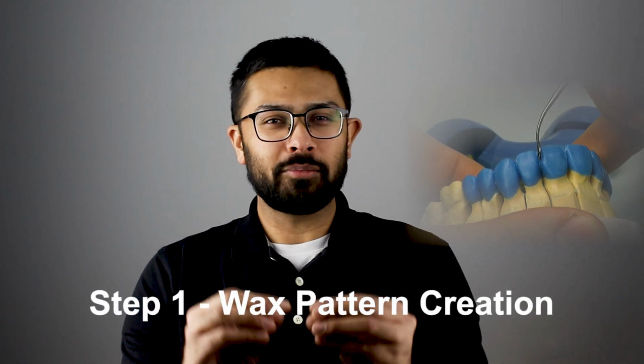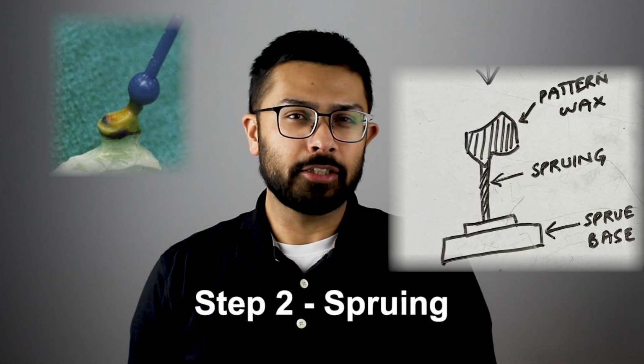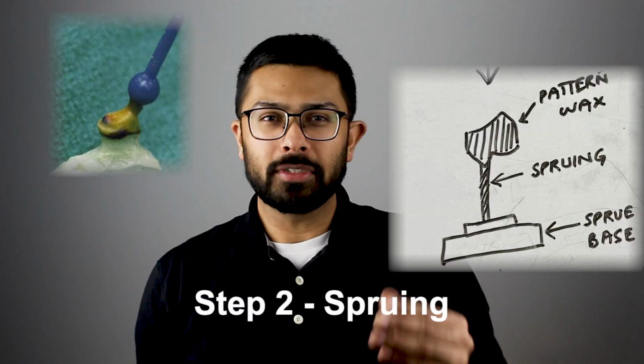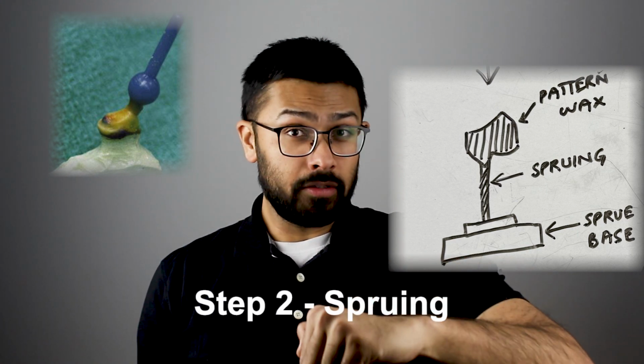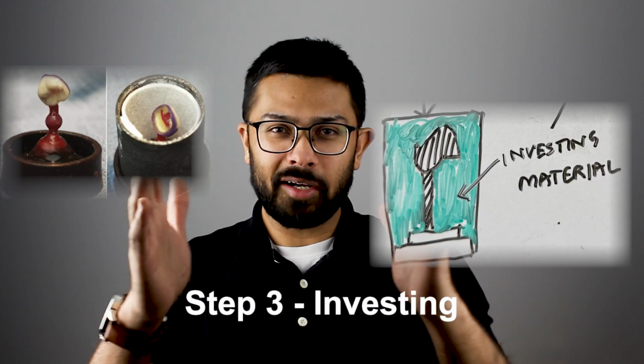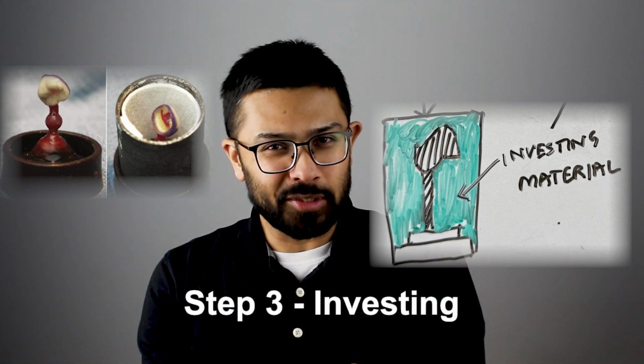So the first step in lost wax technique is wax pattern creation. A detailed wax model of the restoration is made directly on the die to replicate the final shape accurately. Now the next step is sprueing. A sprue, a small wax rod, is attached to the wax pattern, creating a channel for molten metal to flow. Then the next step is investing. The entire wax pattern and sprue are enclosed in a casting ring filled with a heat-resistant material called investment material.